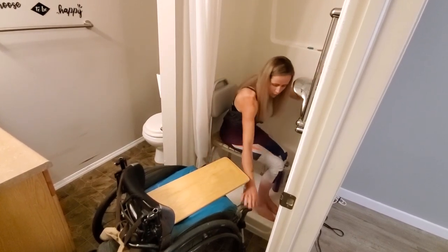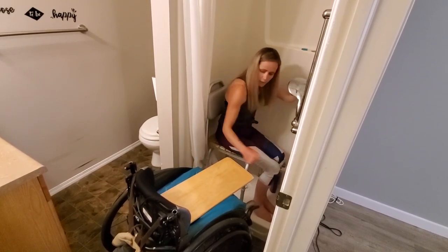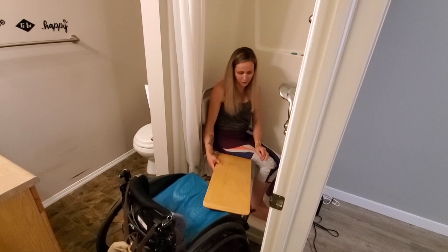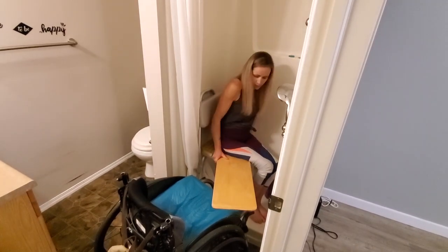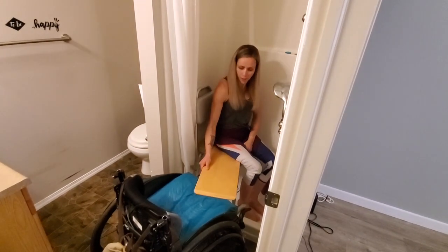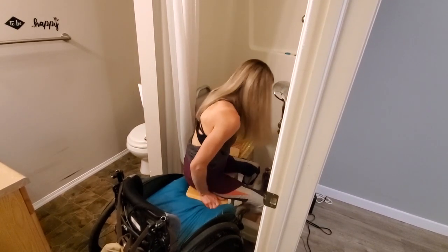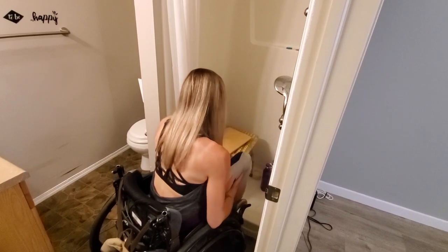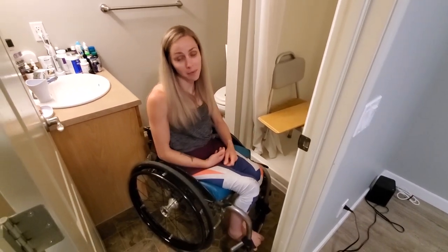When I was coming out I did the opposite direction. Basically the opposite — lift up my leg to get the transfer board under it, make sure it spans the distance, and then just slide across. And that's how I get in my shower — two ways!